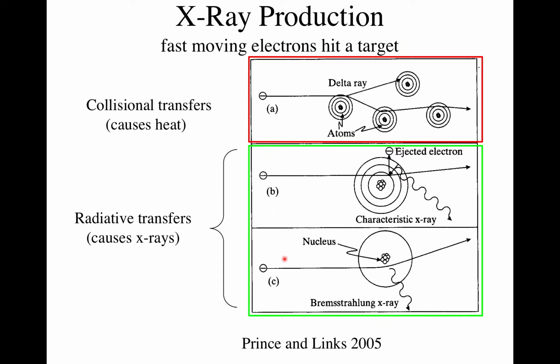But principally, the X-rays we're going to use come from this source, which is called Bremsstrahlung. And Bremsstrahlung is German for braking, apparently. So what happens is the electron comes through and interacts with the atom by getting accelerated from an electrostatic effect, sort of a charge effect. It gets really close to the nucleus, takes a hard turn, and then it loses energy in that process, and the energy comes out as a photon.